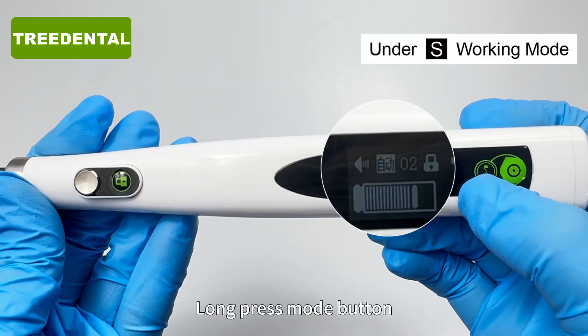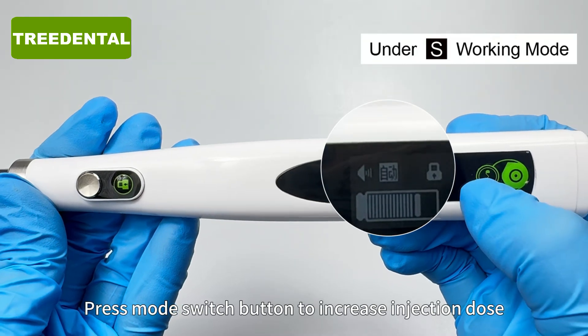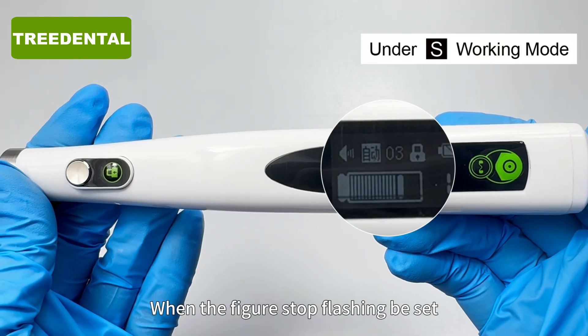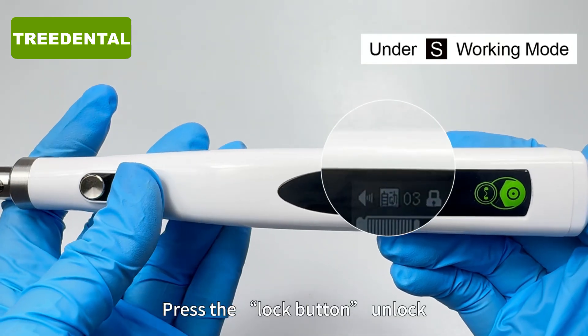Long press the mode button. The auto right side figure flashes. Press the mode switch button to increase the injection dose, or press the power button to decrease it. When the figure stops flashing, the dose is set. Press the lock button to unlock.